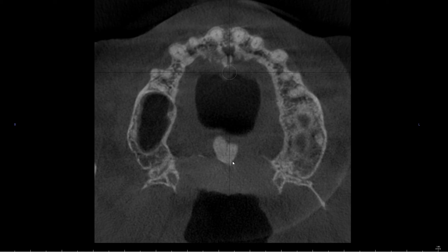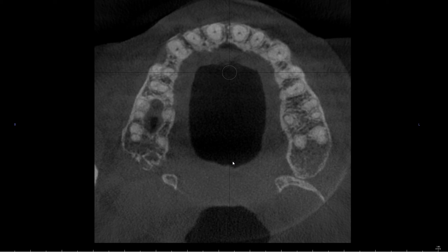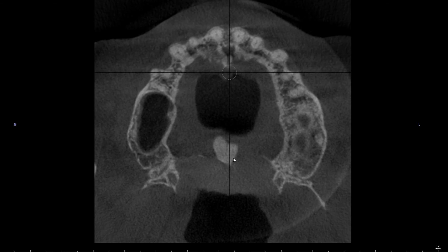Now I'm going to continue to scroll downwards. And from a previous video, we've identified the nasopalatine foramen, or the canal.